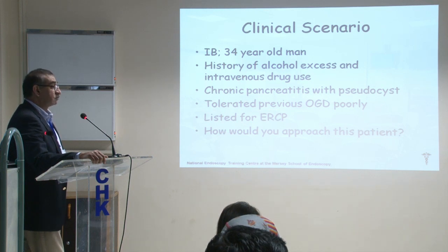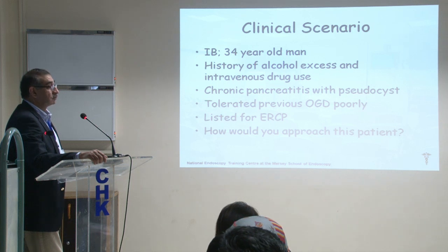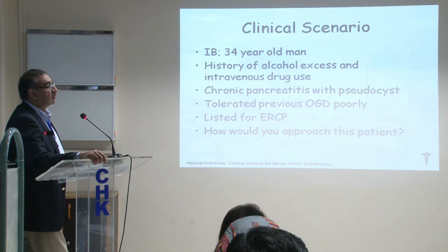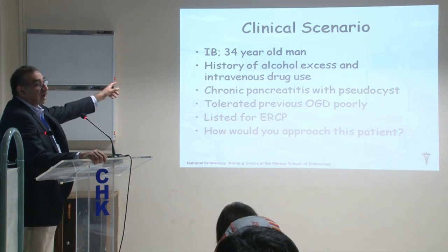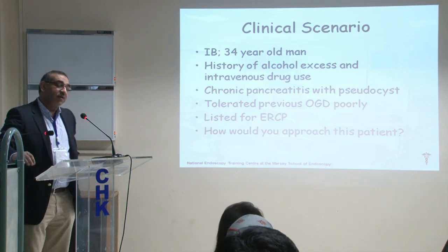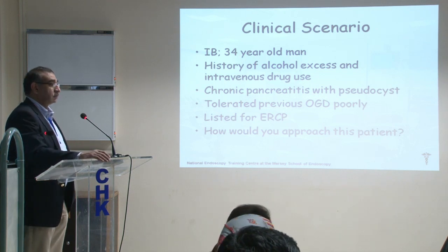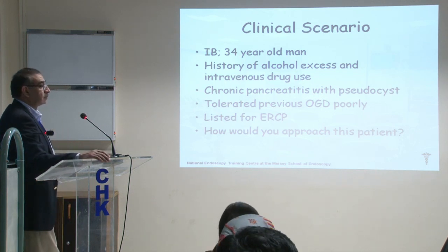Yeah. So with this history, even without this history, just the fact that we need to drain a pseudocyst, and this is our practice, all pseudocyst and pancreatic therapy is done under anesthesia. I have not done it under sedation. And these alcoholics usually end up requiring it. The other problem is he's an IV drug abuser as well, so you'd require very high doses of opioid. Yes, high tolerance.